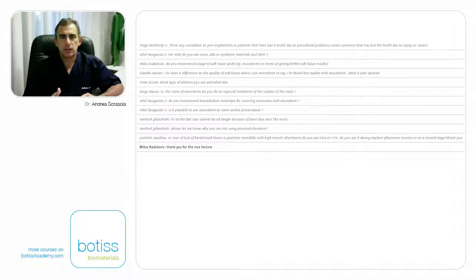I know that there is not a very high level of experience in literature, but I would like to augment this clinical case, and I think that is a good solution first of all when we have problems for the palatal vault, and when there is some difficult situation with some patients. So I think that could be a very good solution.